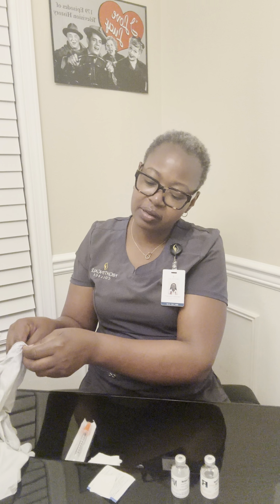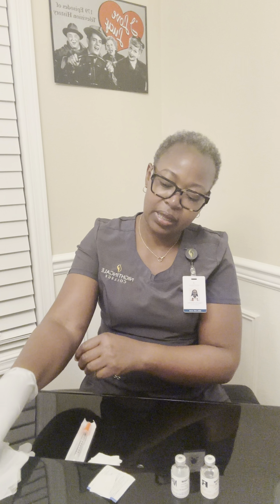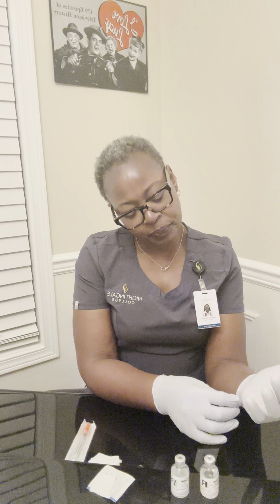Okay, so then I'll go ahead and perform hand hygiene and don clean gloves. So Mrs. Smith, the reason why I'm here is because I have your insulin, and the reason for giving you insulin is for management of diabetes, type 1 and type 2 diabetes.